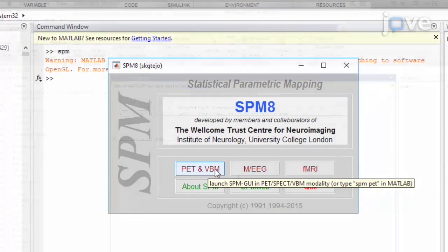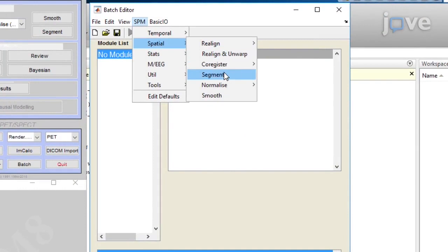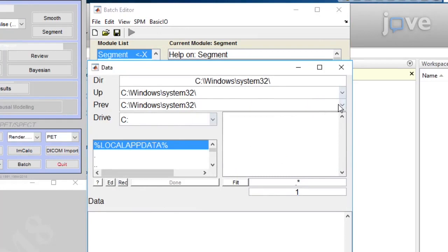Now, open the batch editor to perform segmentation on multiple scans at once. Select SPM, Spatial and Segment, then Data, select Files, and choose the T1 Weighted Scans as input.